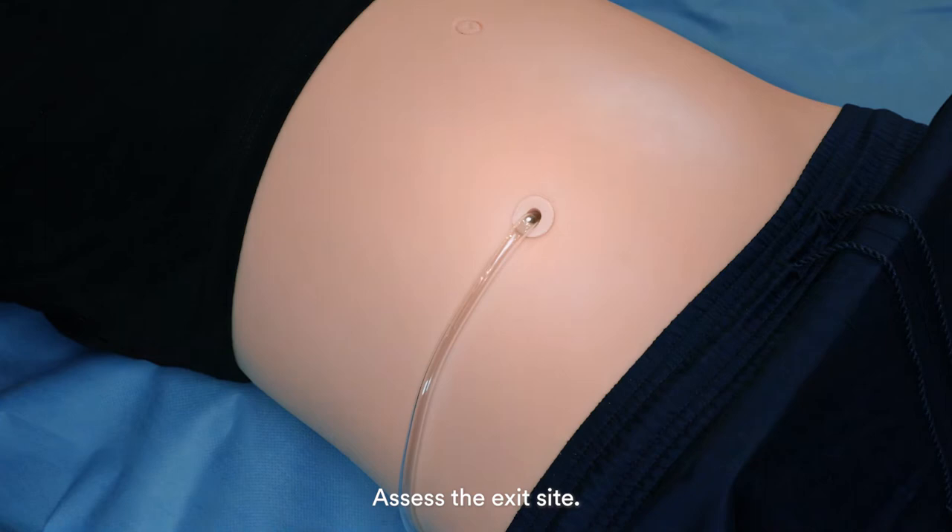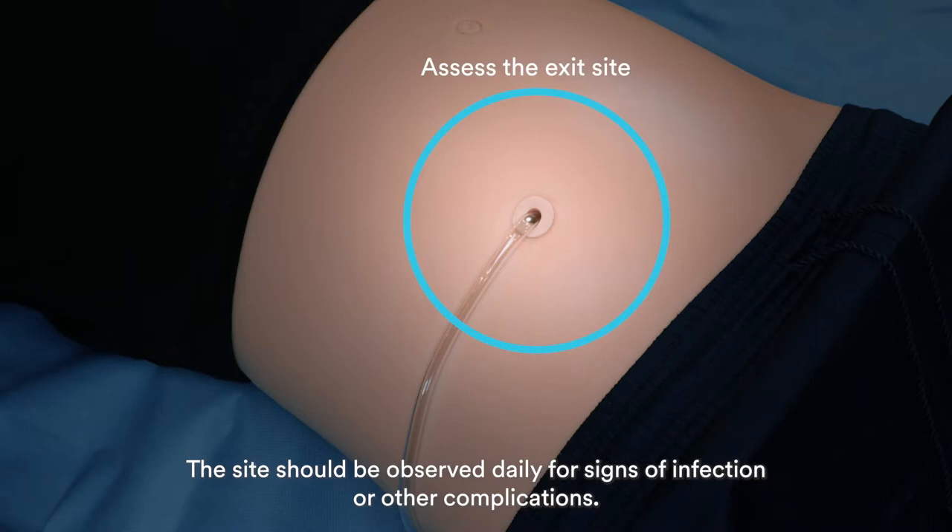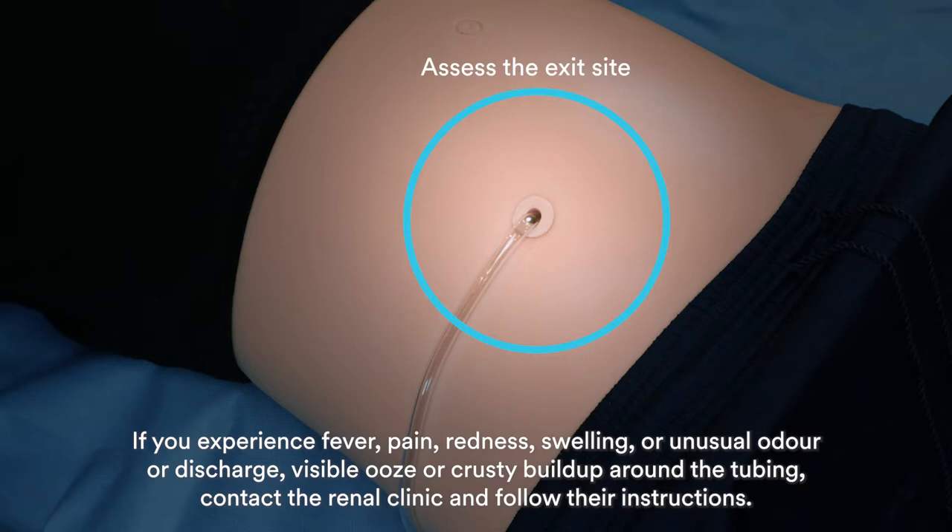Assess the exit site. The site should be observed daily for signs of infection or other complications. If you experience fever, pain, redness, swelling, or unusual odor or discharge, visible ooze or crusty buildup around the tubing, contact the renal clinic and follow their instructions.